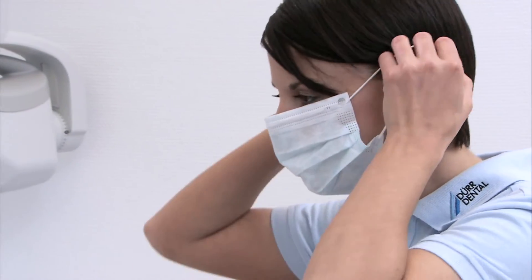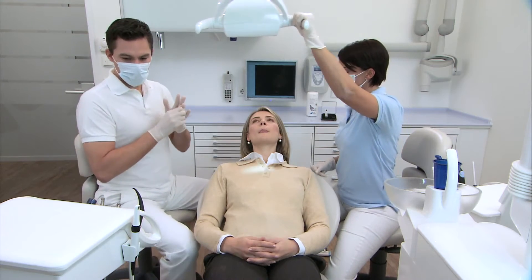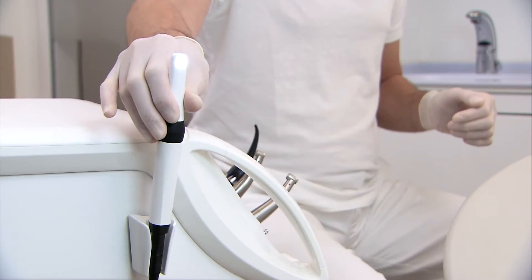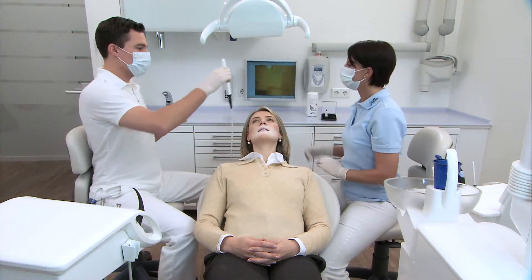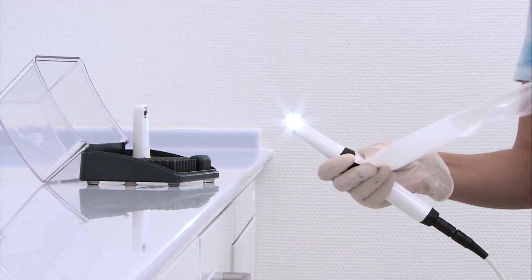The Vistacam iX combines intraoral and fluorescence imaging in a single camera and ensures the highest level of image quality and depth of field with full digital image transmission. The perfectly round, sophisticated positioning of the LEDs in the camera head ensures optimal, even illumination.